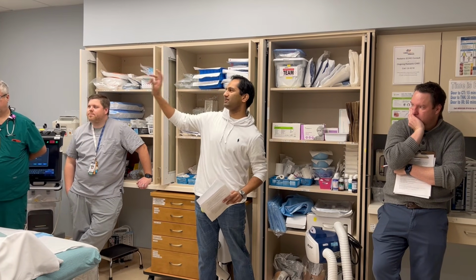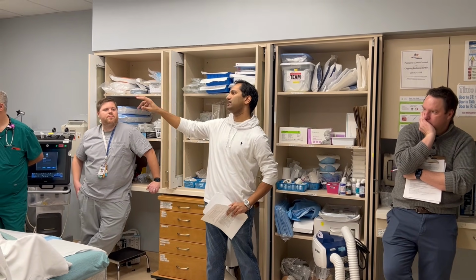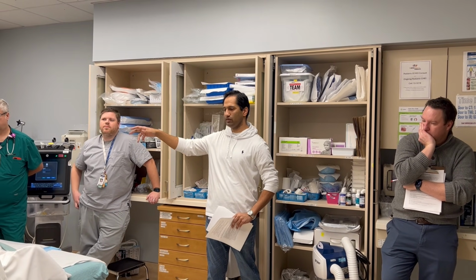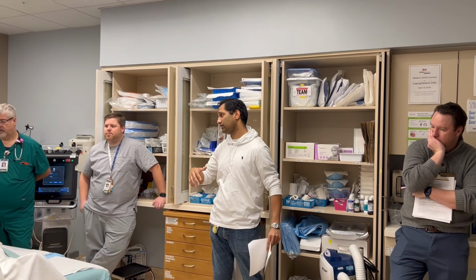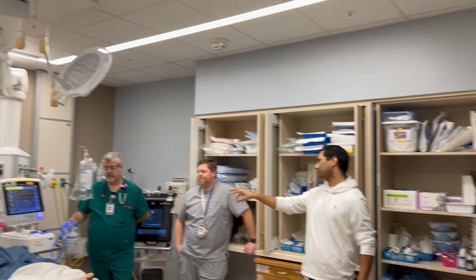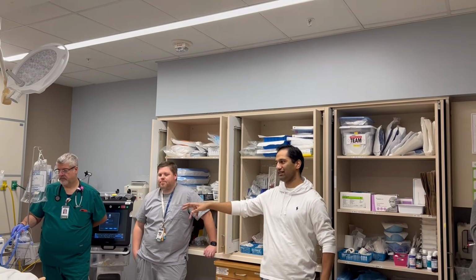The other thing is the vital signs monitor. Some of the things are going to come through. You will not get end tidal and you will not get saturations on that, so I will just verbalize those if they're changing at all. And this is hooked up to, I believe, an artificial lung, right? So it's giving you numbers, but it may not work perfectly in that either.